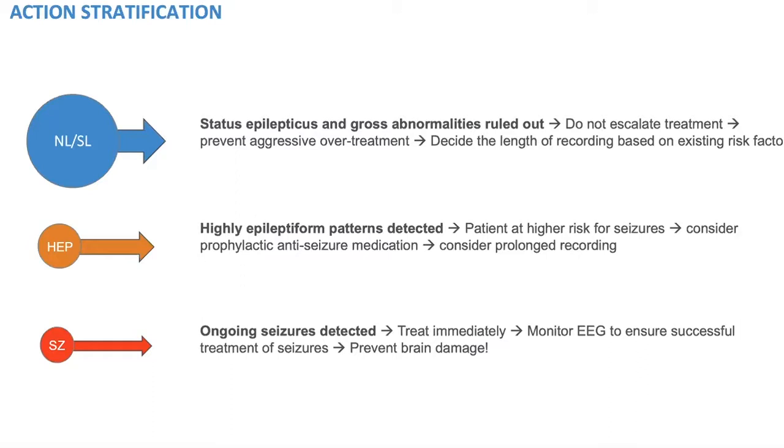And as you will see in this course on EEG, we will refrain from using sophisticated terminologies that have unfortunately often served as a source of confusion rather than a source of help. An EEG reader reads something and writes a very lengthy procedure note that may not be of use for an ICUer, because it doesn't really guide the ICUer in terms of what to do.